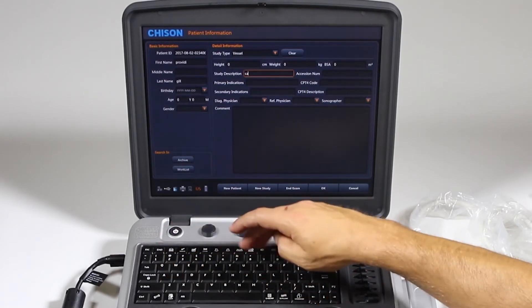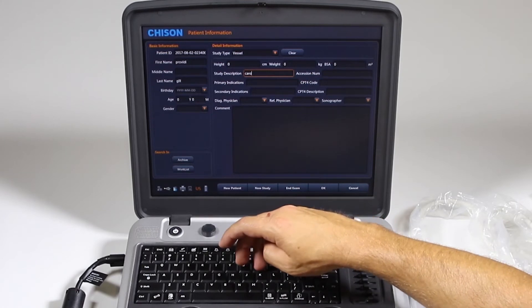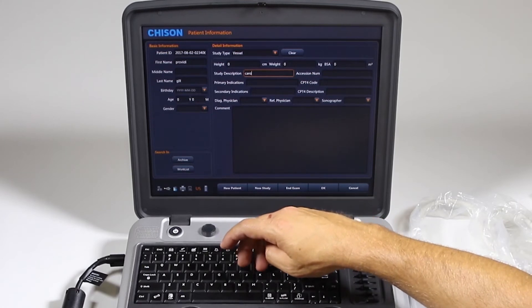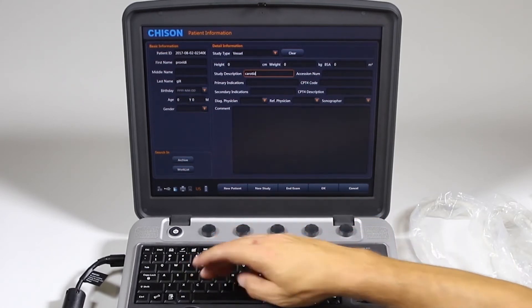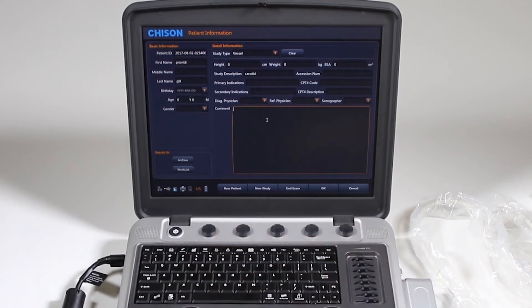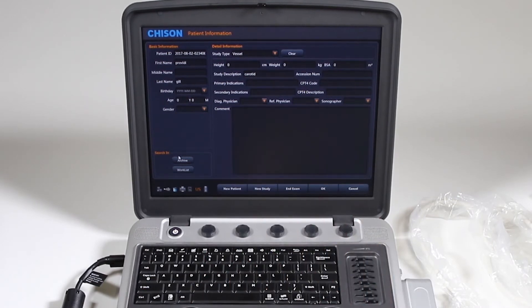So if you're just doing a carotid, you type that in and that would show up on that. Okay, so that's if we have a new patient.